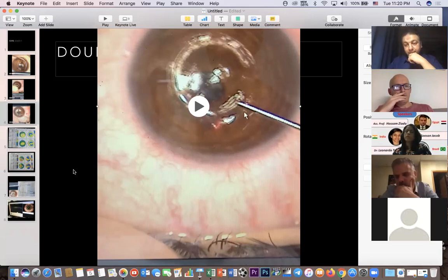You know, two segments will always give you a greater decrease in sphere, because you're actually pushing everything to the side and you're flattening the cone. So with two segments, your spherical power will decrease more. A single segment is more aimed at, like Dr. Ife said, decreasing the coma, aberrations, things like that. If you want to target cylinder specifically, you can again use two segments and decrease the arc length so that you're acting on a more localized axis. So that's one way of targeting cylinder alone. So whatever kind of effect you want, you can tailor it by changing the degree of arc length and all that. And again, like Dr. Leonardo had mentioned in the beginning, you can make the optic zone smaller to get a more pronounced effect. So there are really lots of ways that you can change the effect that you get.